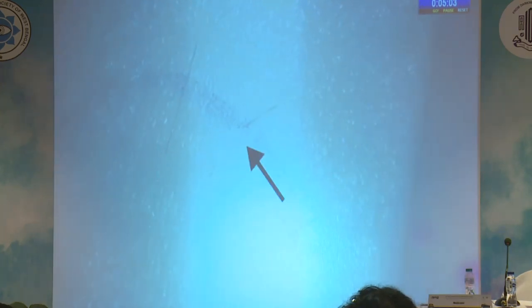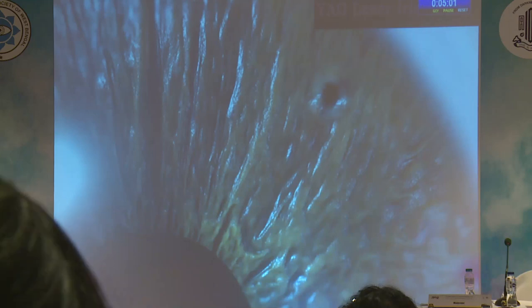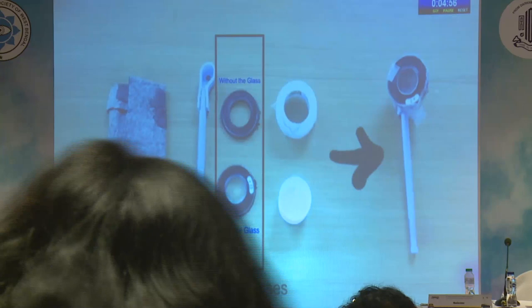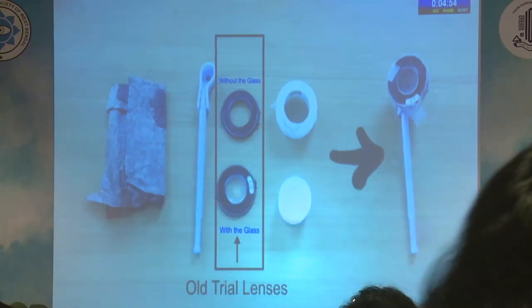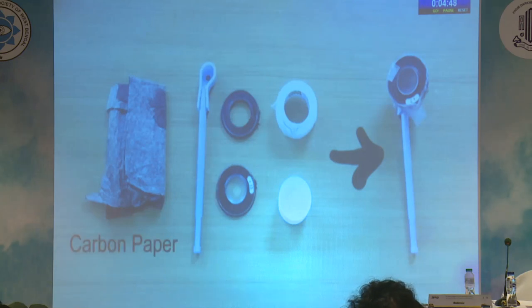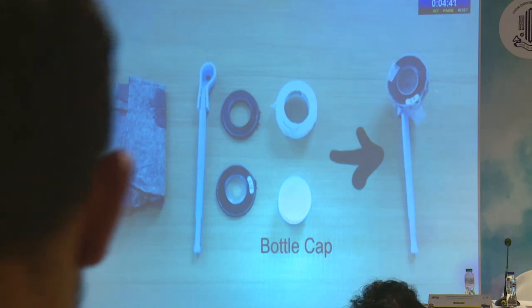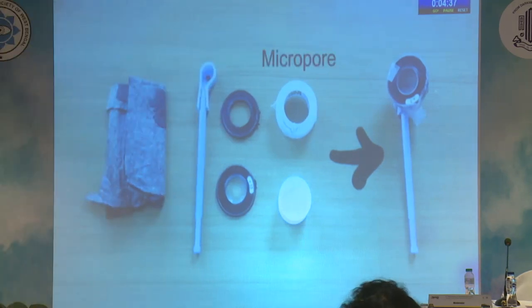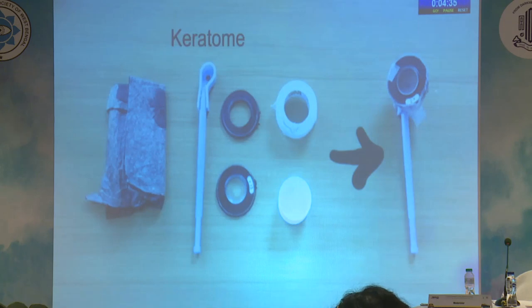We made another eyeball for laser peripheral iridotomy, for which we used: one, old trial lenses, ones with the glass to mimic the cornea and ones without the glass to give a little bit of depth to mimic the anterior chamber. Two, a carbon paper to mimic the iris. Three, a waste bottle cap, preferably red, which acted as the posterior segment and the red contour mimicked the fundal glow. Four, micropore to tie it all up together. Five, a used keratome to mount on the laser slit lamp.